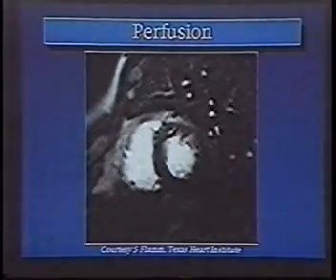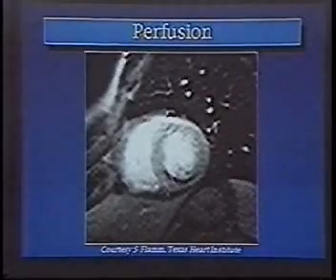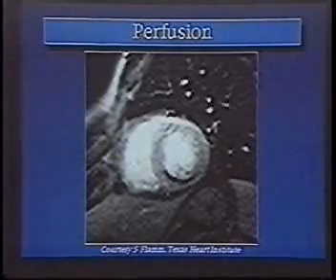Okay, notice the chambers are enhancing. Now the myocardium is enhancing. But there's one area down here that's not enhancing. There's a subendocardial perfusion defect in the inferior wall.